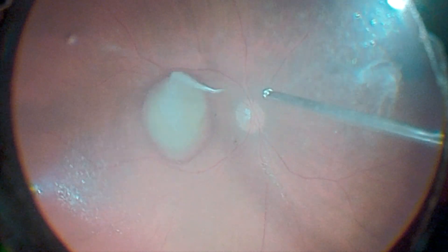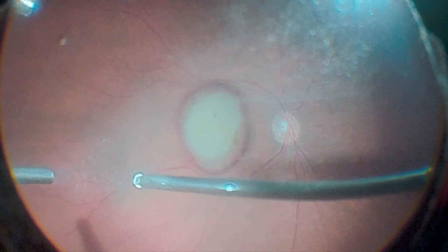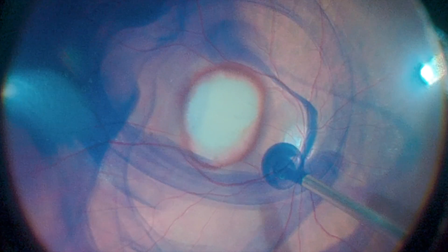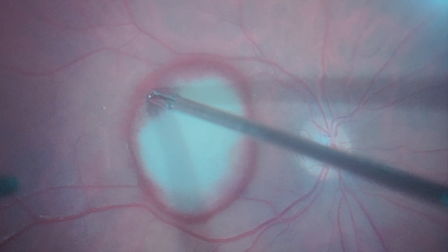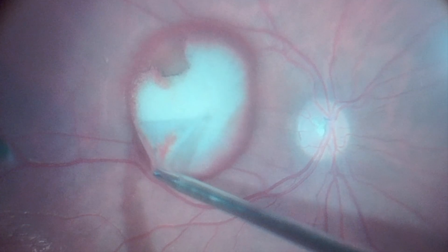Triamcinolone is used to stain the posterior hyaloid. Then, posterior hyaloid detachment is performed using the vitrector. Brilliant blue dye is then used to stain the internal limiting membrane. The internal limiting membrane peeling is performed using an Eckhart retinal forceps.